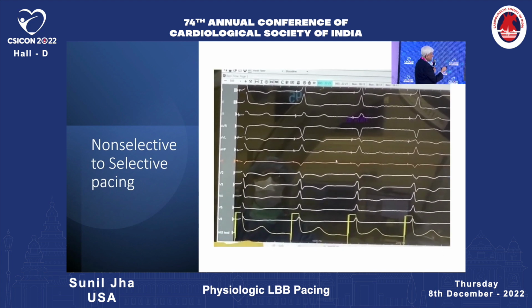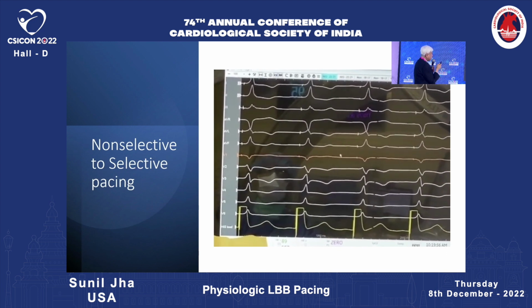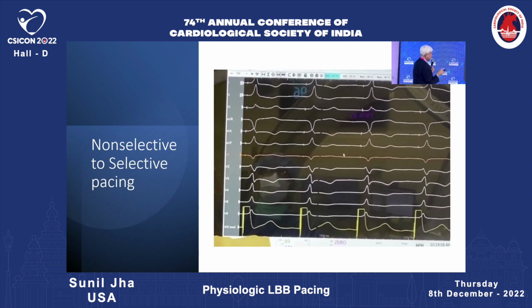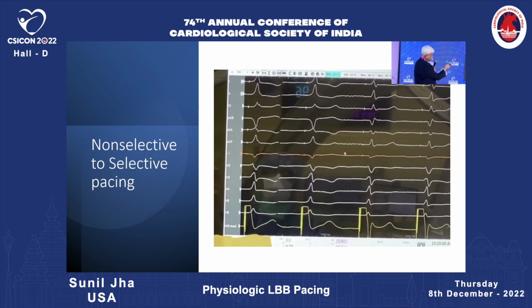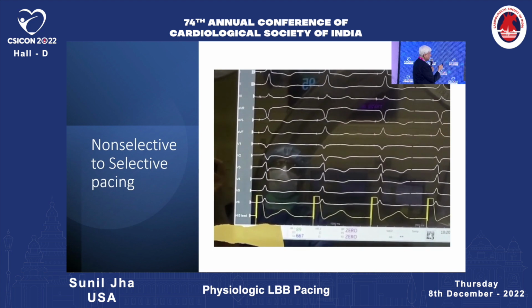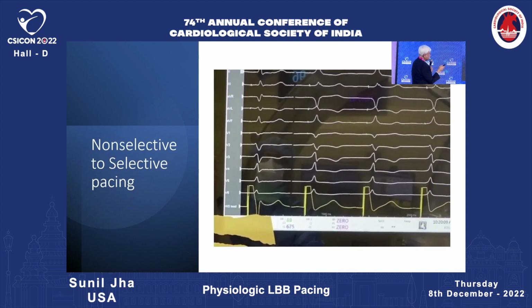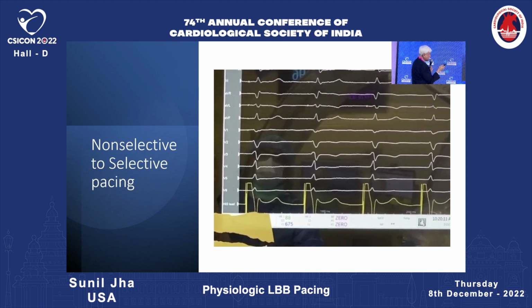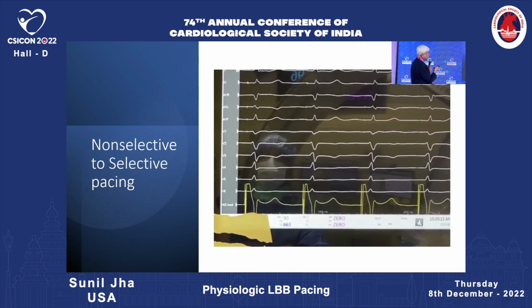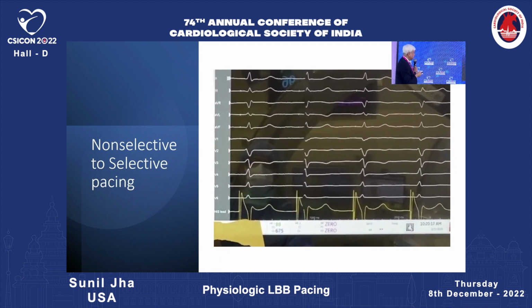So here you are still non-selective, okay, it's still non-selective, and then selective now. You got the local electrogram, again non-selective, and finally it becomes all selective, and finally you lose the capture. So this is from the non-selective to the selective mode.